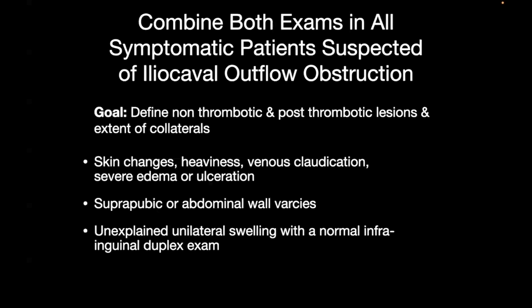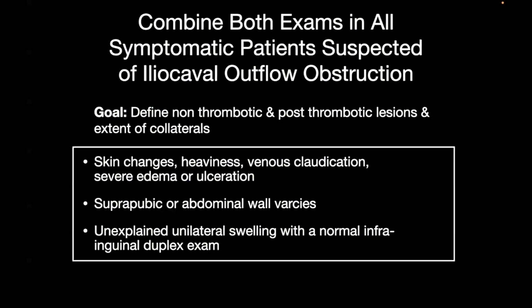The guidelines suggest that we combine both exams in all symptomatic patients suspected of iliocaval outflow obstruction. So the goal here is to define non-thrombotic and post-thrombotic lesions and the extent of collateral veins, and there are certainly other causes too. And these are the patients that are coming into our labs every day. They have skin changes, they have heaviness, they have venous claudication, severe edema or ulceration.